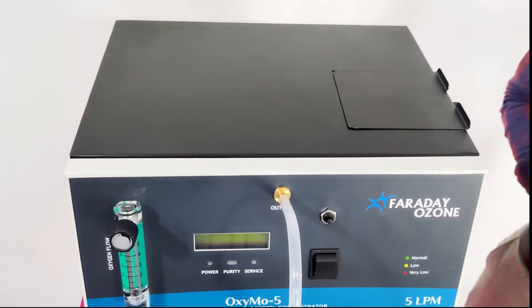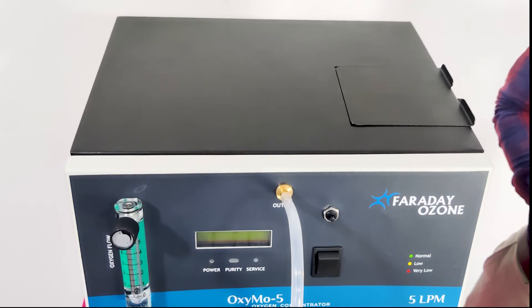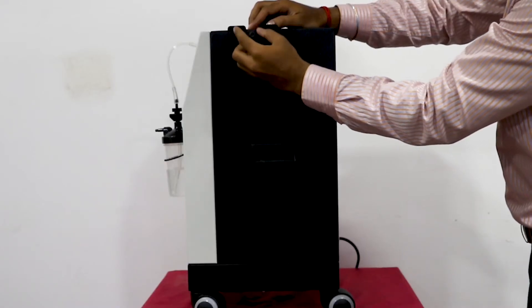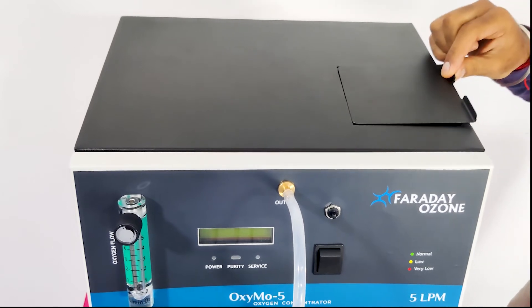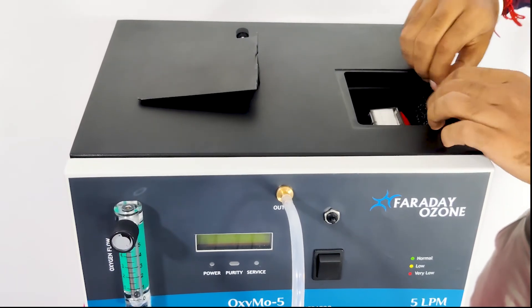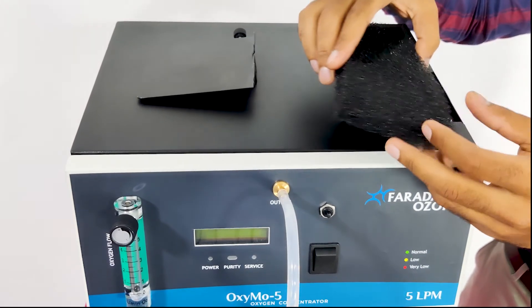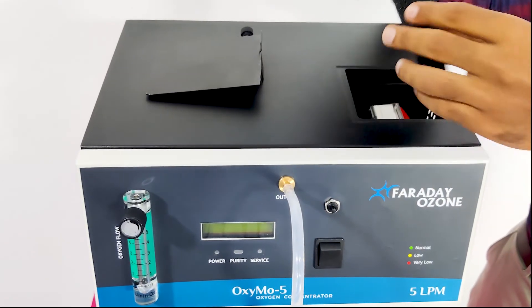In the maintenance part, we have two things to be done. First, check the primary air filter every two weeks and clean it regularly. To clean the primary air filter, rotate the knob anti-clockwise, take out the primary air filter, and just shake it or clean it to remove the dust. Once it is dried, put it back into the machine.